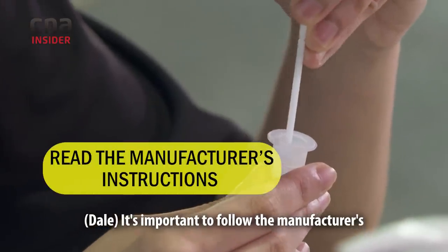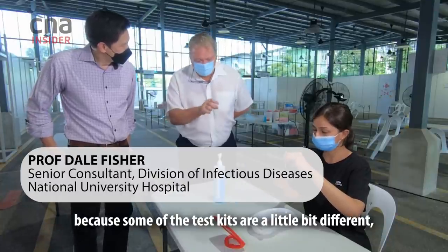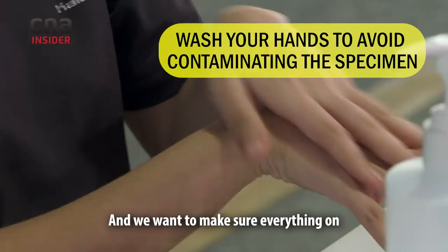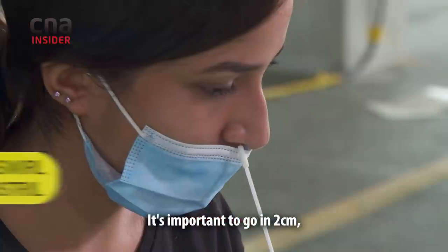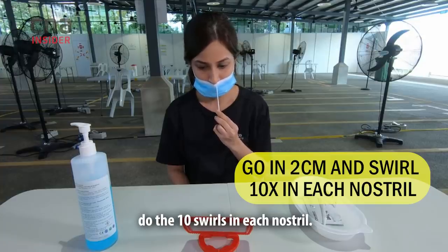It's important to follow the manufacturer's instructions because some test kits are a little bit different, but this is what we do for this one. The first thing she's doing is washing her hands — we want to make sure everything on the specimen is actually from her nose. It's important to go in two centimetres and do 10 swirls in each nostril.